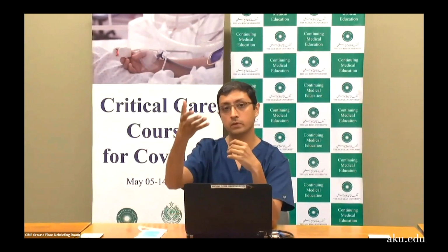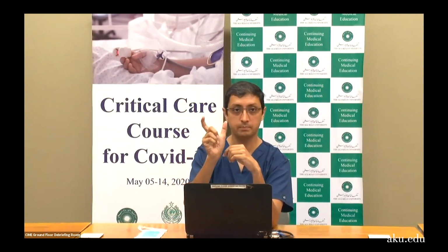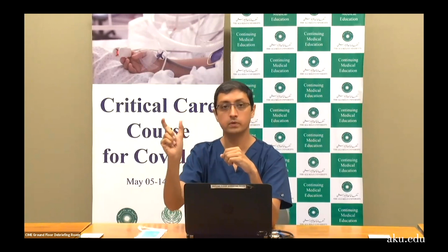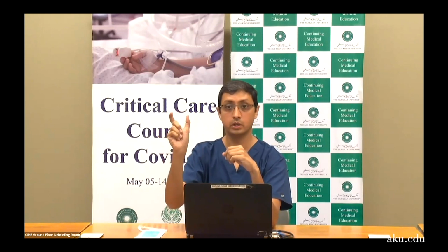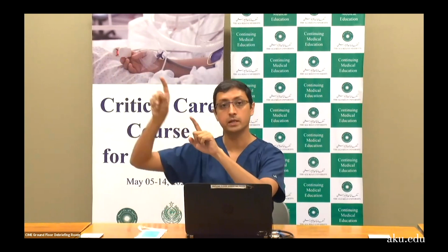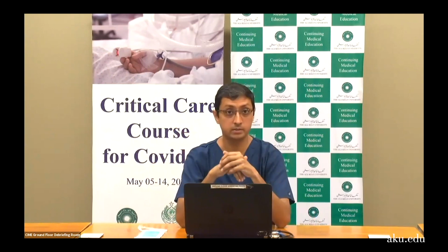Whereas with the volume, you have the volume fixed. If you have fixed 400 ml, the ventilator will deliver 400 ml. It will not deliver 450. The problem then is that airway pressures will vary with each breath. I hope that answers and makes things easier.